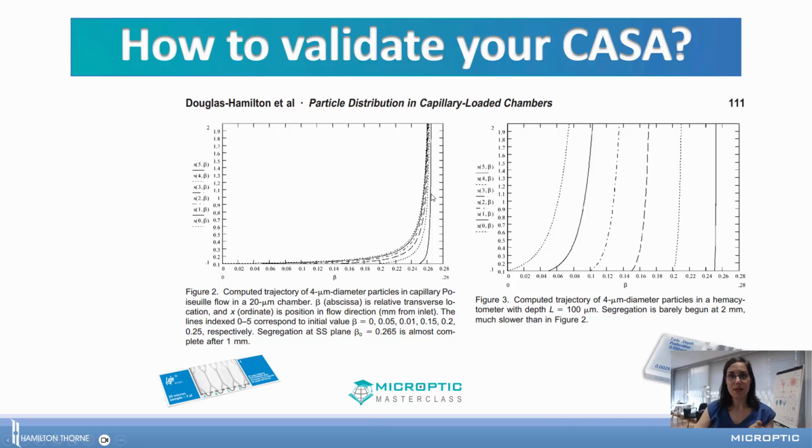Conversely, on the improved Neubauer chamber, despite the sample being spread by capillarity too, the huge depth of the chamber minimizes to the maximum this transversal movement of the cells through specific planes.